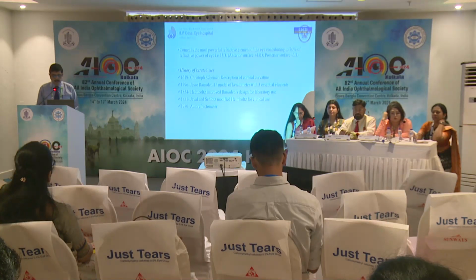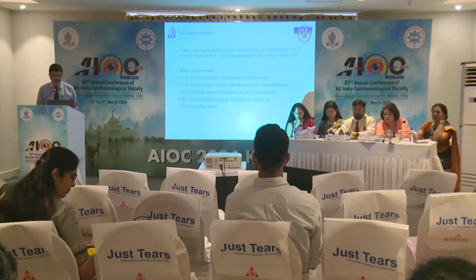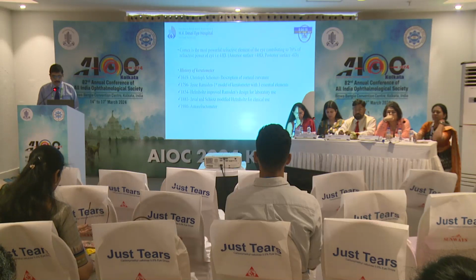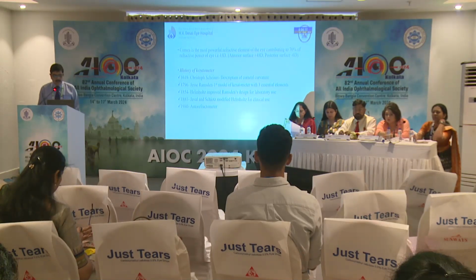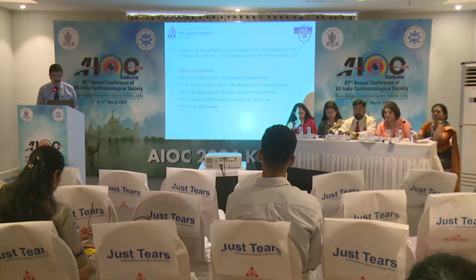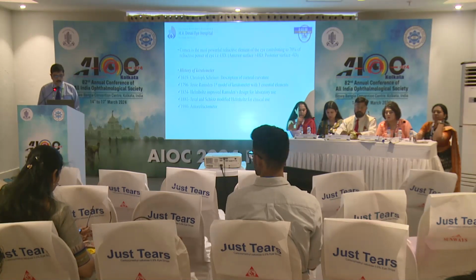Cornea, as we know, is the most powerful refractive element of the eye, contributing about 70% of the refractive power of 43 diopters. Anterior surface contributes about 48 diopters and posterior a -6. Keratometry started as early as in 1619 when a Jesuit priest called Christoph Scheiner started studying the corneal curvature and tried to measure it. Over the years, it got better, and we developed a keratometer for clinical use.